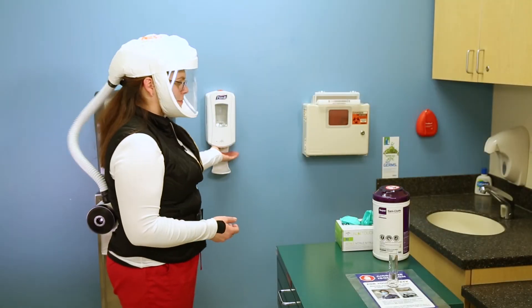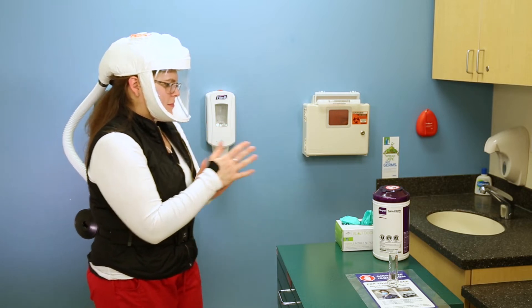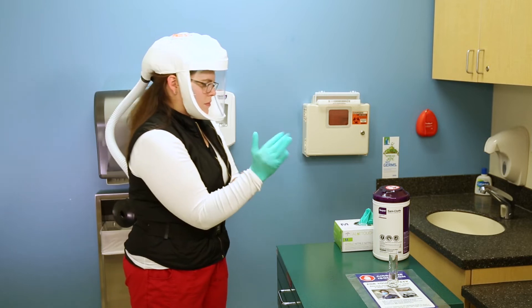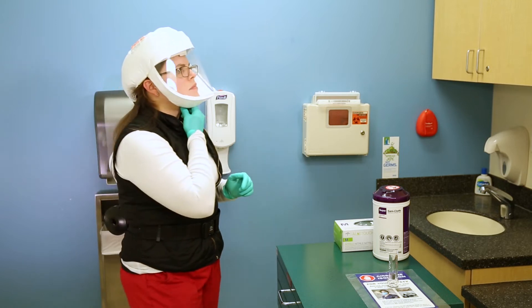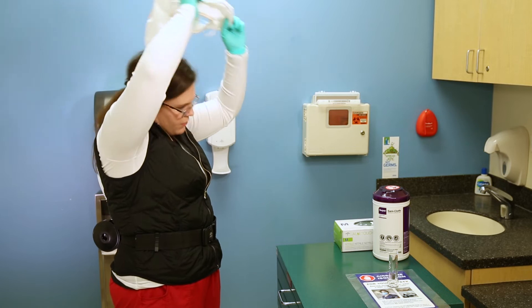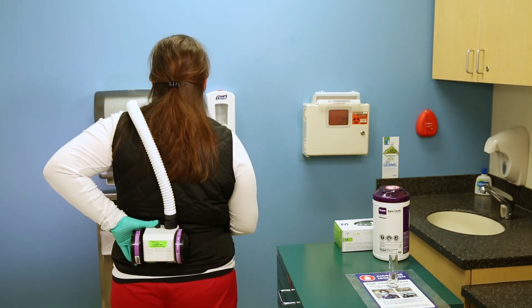When doffing your PAPR machine, remove yourself completely from the room and shut the door. Perform hand hygiene. Place a clean pair of gloves on, and remove the hood by loosening the bungee and pulling it off from under your chin and towards the back of your head. Then you may turn your machine off.